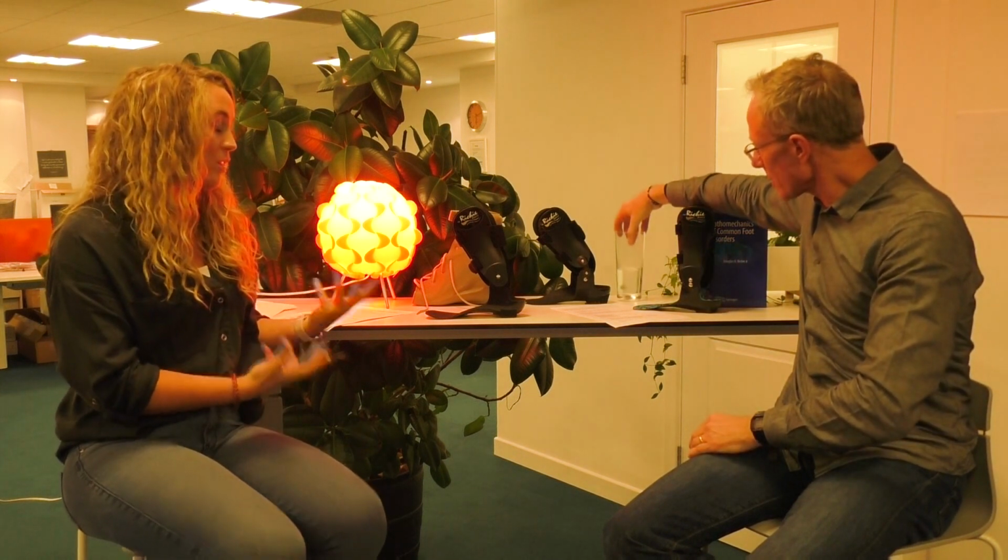Yeah, adult acquired flatfoot is definitely an interesting one. I mean, it's been hard. I've been trying to look up the literature behind treating it and when to treat it, and across the board it says that stage 1 to 2 adult acquired flatfoot you treat with a custom-made foot orthotic or an AFO, but once it gets to 2B all the way through, the rest is surgery.